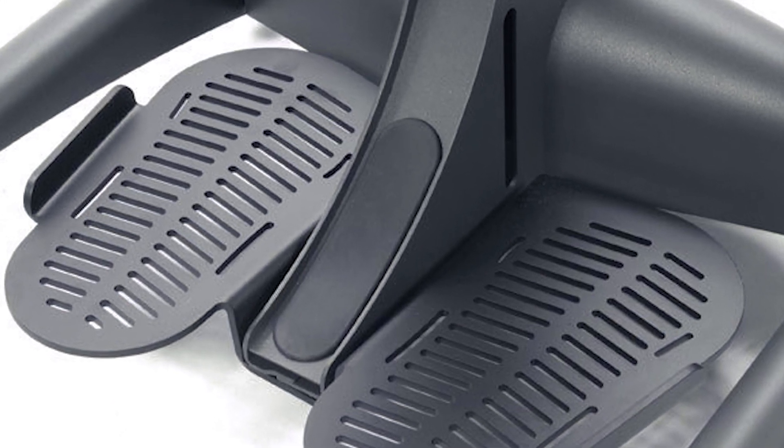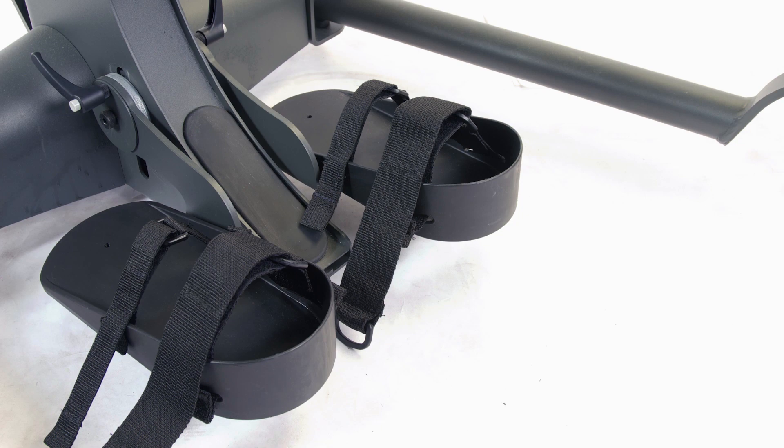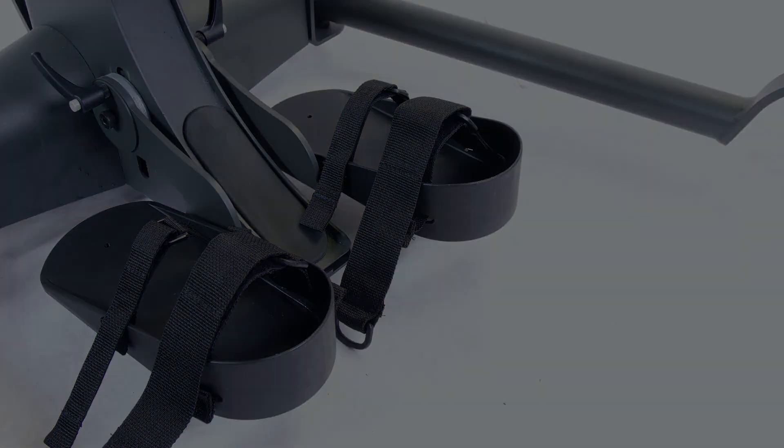The extra-large footplates are not adjustable. Several strap options are available for the footplates, using Velcro and D-ring adjustment to hold the feet securely in place.